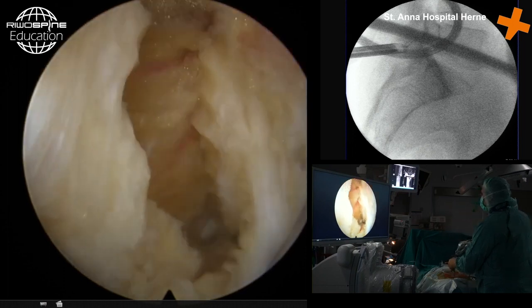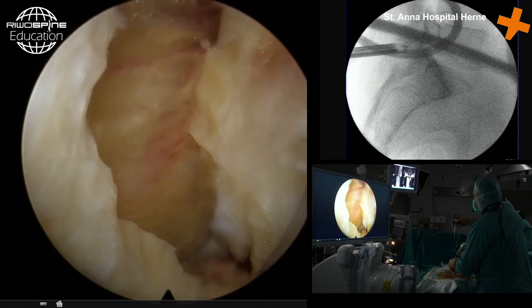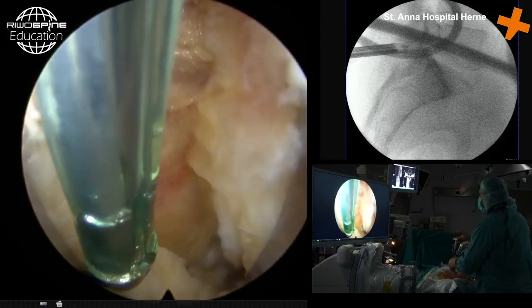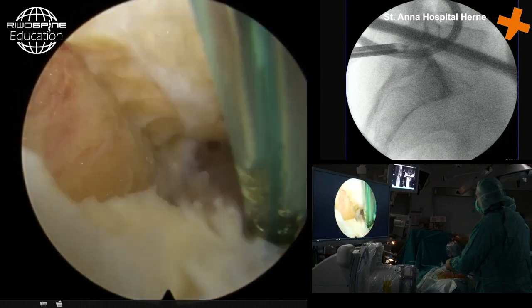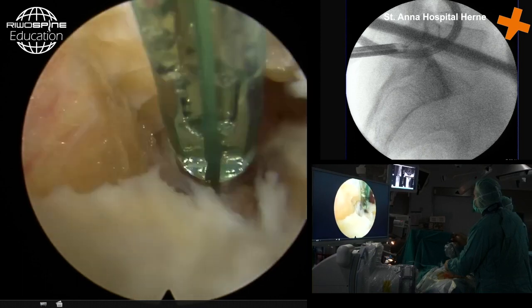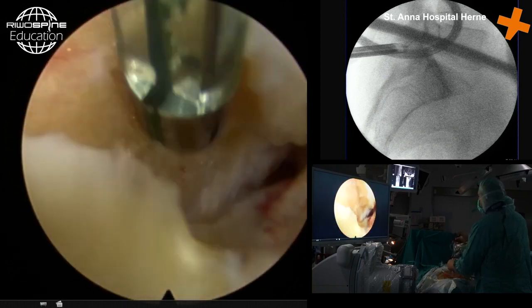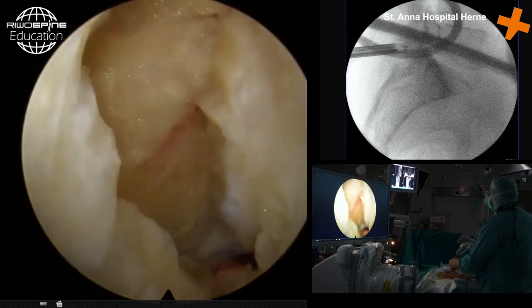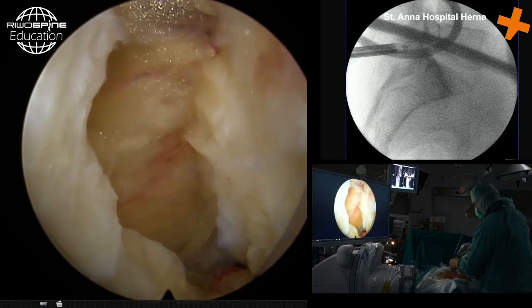I give you an orientation again. So we started medially to open the flavum ligament. Left side is caudal, right side is cranial. Here we see the joint, that means descending facet, ascending facet. And we open the flavum ligament until we find the medial margin of the ascending facet. Now we have to resect parts of the epidural fat to identify the neurostructures clearly.